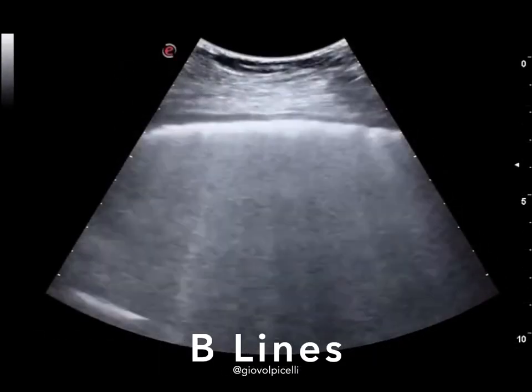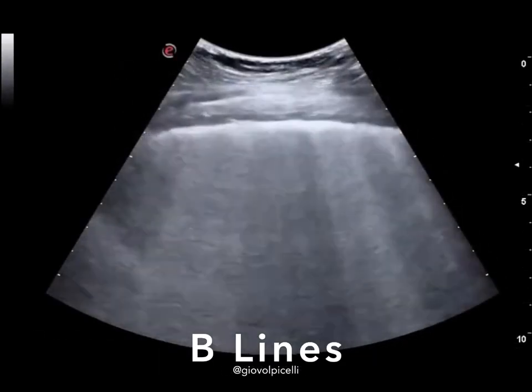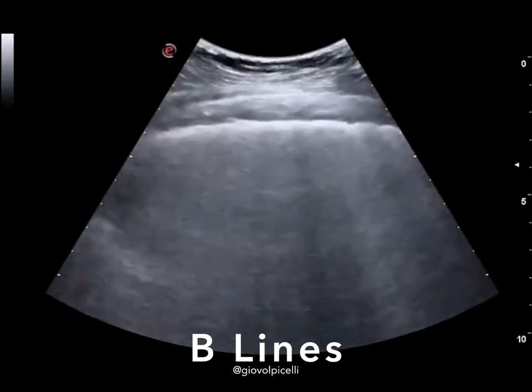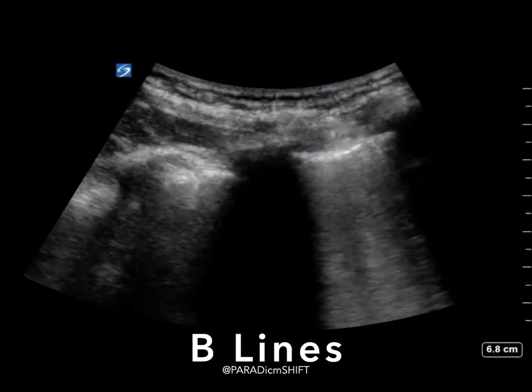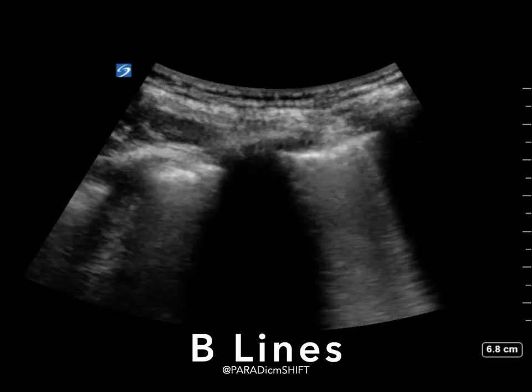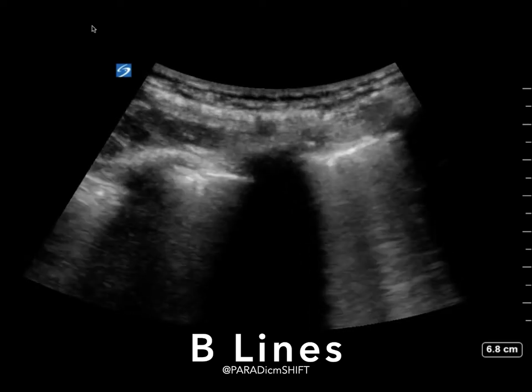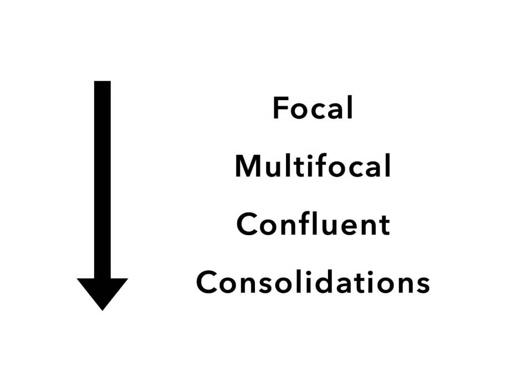Patients can also develop B lines, as these two examples demonstrate. B lines can take on many different appearances depending on the progression of disease. They can appear focally, they can be multifocal — often with spared areas in between called skip lesions — and they can become confluent. The theory is that with further progression, confluent B lines can develop into frank consolidations.